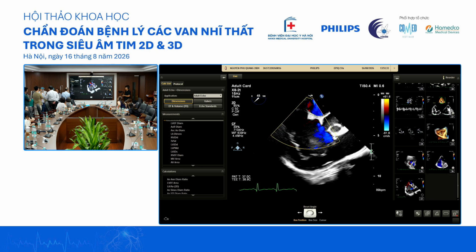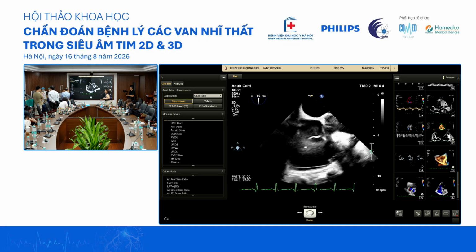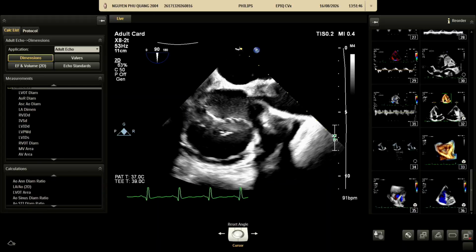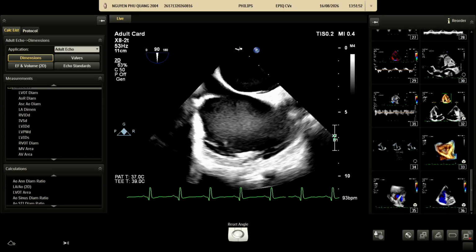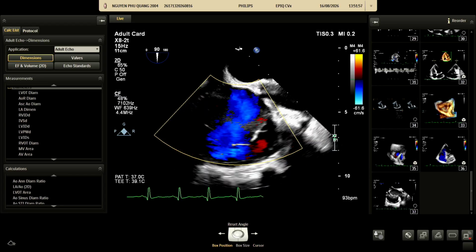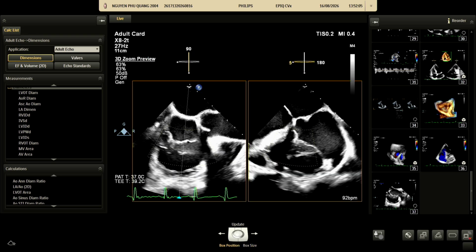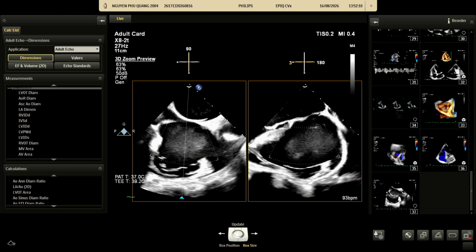So you're going to finish with the transthoracic, then you go into transesophageal. At 90 degrees you don't see any problem. We try to get it. We should be able to get this very echogenic.